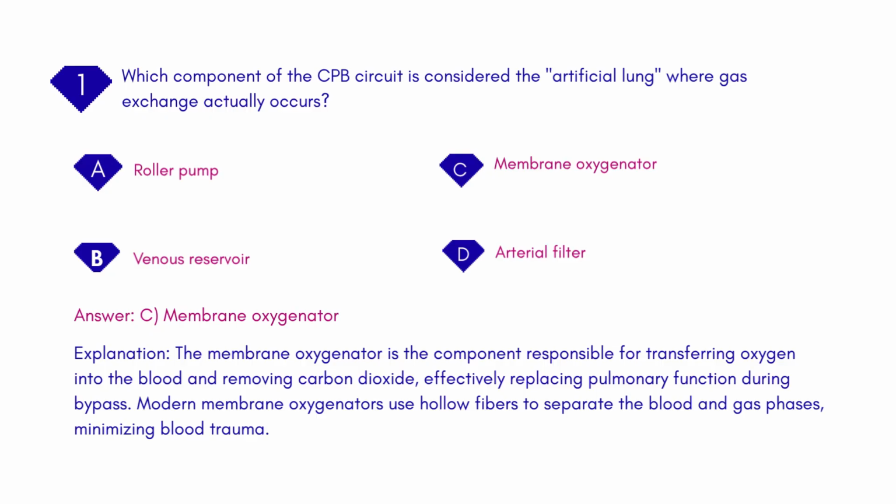Modern membrane oxygenators use hollow fibers to separate the blood and gas phases, minimizing blood trauma.